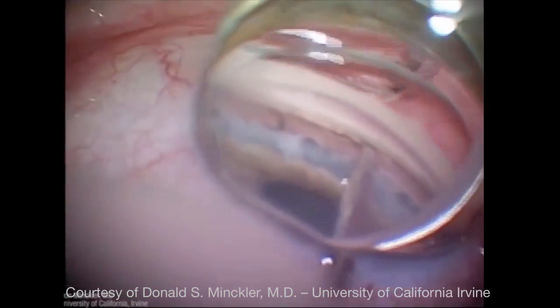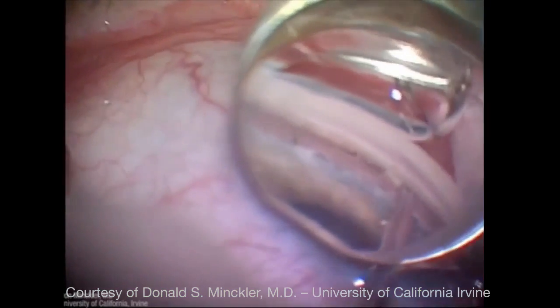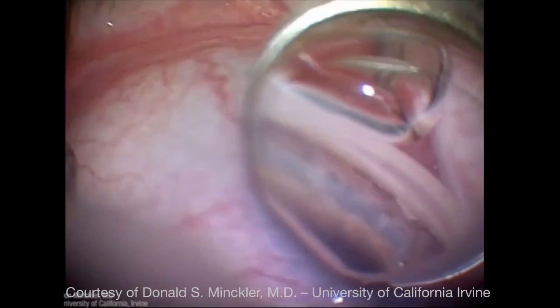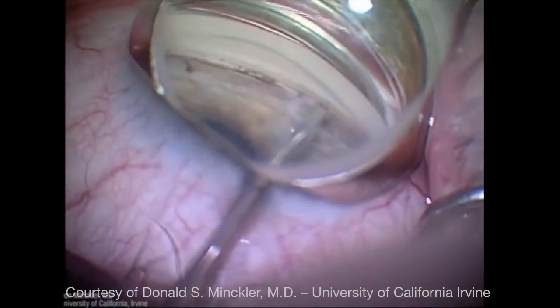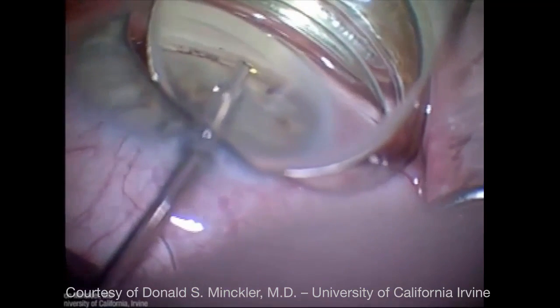There is an insulator that protects the canal wall from being damaged. The trabectome is sometimes done in conjunction with cataract surgery. This is a patient who had the trabectome recently — you can see the white opening where the posterior wall of Schlemm's canal is visible with no overlying trabecular structures.